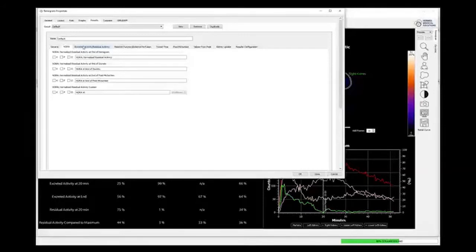Yes. I know it's a strange thing, because Hermes have to make this application for everybody, and the Germans seem to love it. As you say, it's certainly not a widely used technique in the UK.